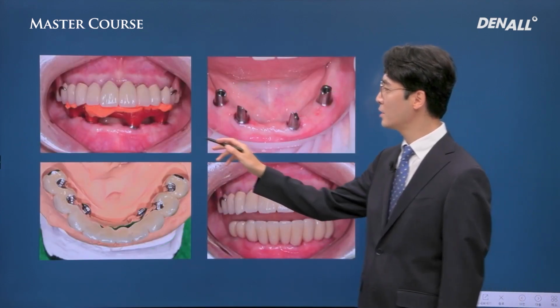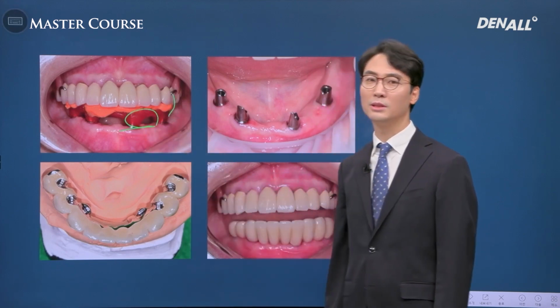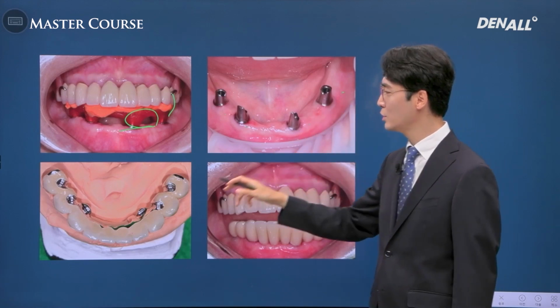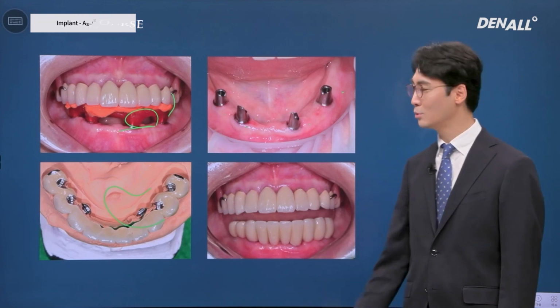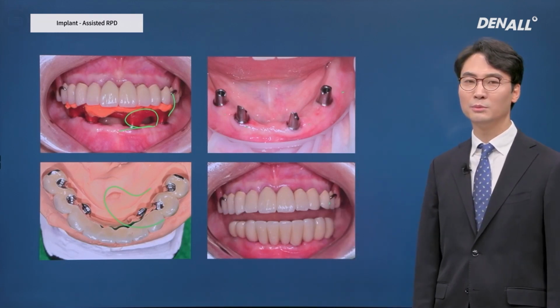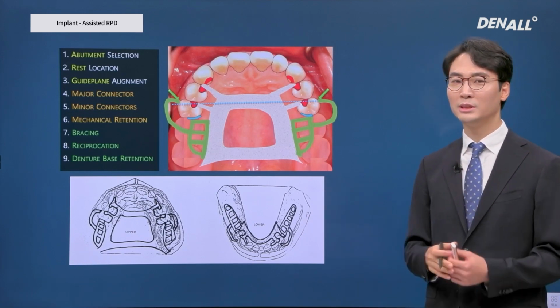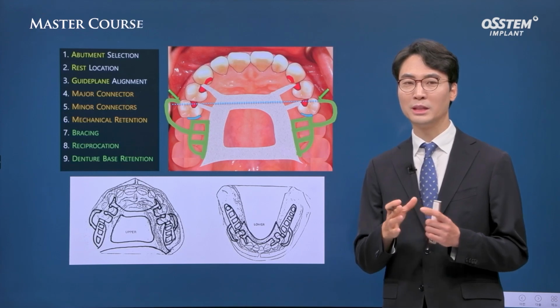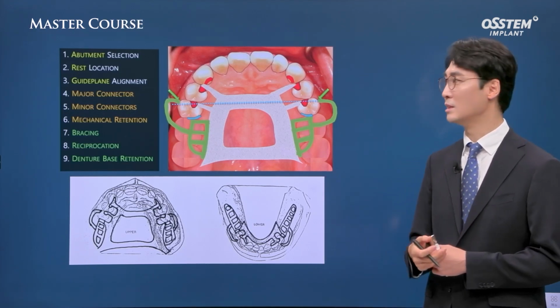After healing, implant level impression was taken, jig was used to take a bite record, and VD was determined. Custom abutments were fabricated, and on top, 10-unit cementation type surveyed bridge was fabricated and delivered. Once this is done, the rest of the process is very similar to designing and fabricating partial denture after providing prosthesis to natural teeth or fixed prosthesis.